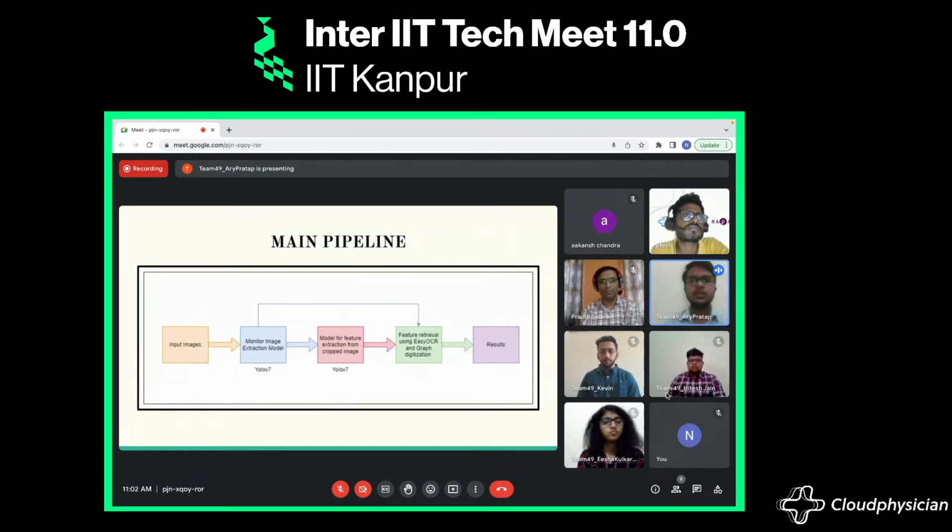Moving towards the main part of our problem statement, this flowchart depicts the main pipeline which we have built. The first stage is the input images that the user gives us. The first primary stage of our pipeline is the monitor image extraction model, represented in this blue box. This is model 1 of our pipeline, a YOLO V7 model trained on the initial 2000 images given. Its main function is to predict the bounding boxes of the monitor screen from the input images, and we use those bounding boxes to extract the monitor screen from the input images.